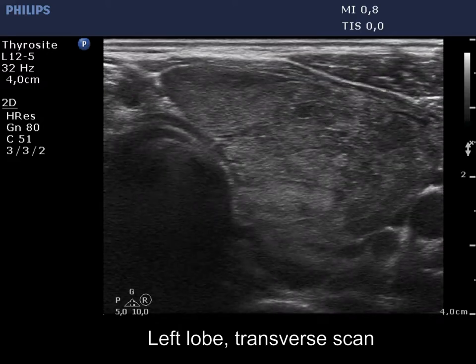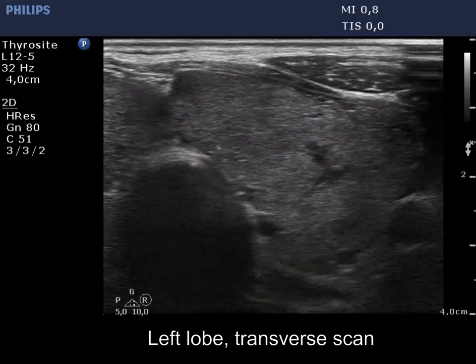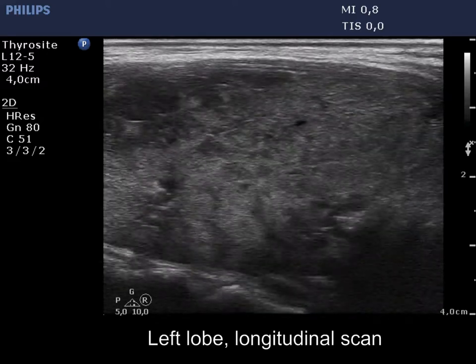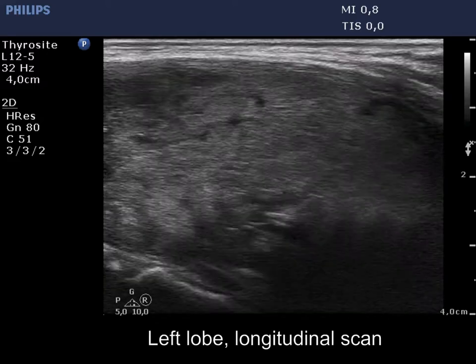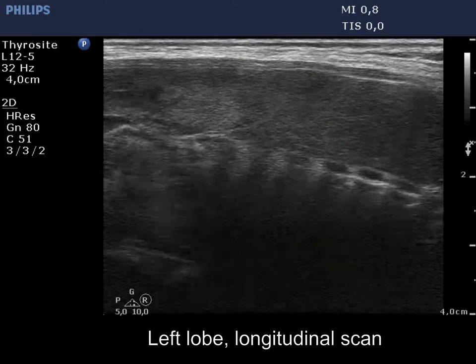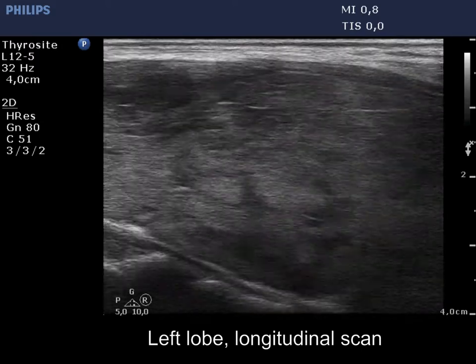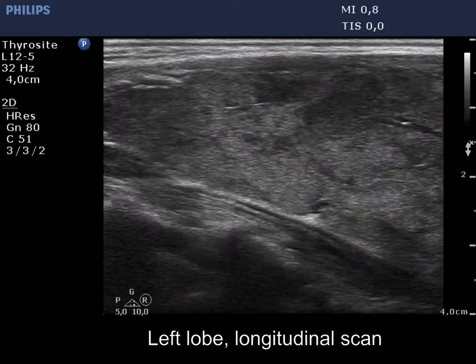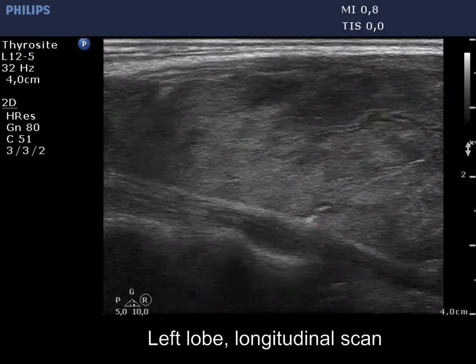The left lobe has a similar appearance. Here we can see hypoechoic fields which are larger than in the right lobe, but neither of them fits a pathological nodule.